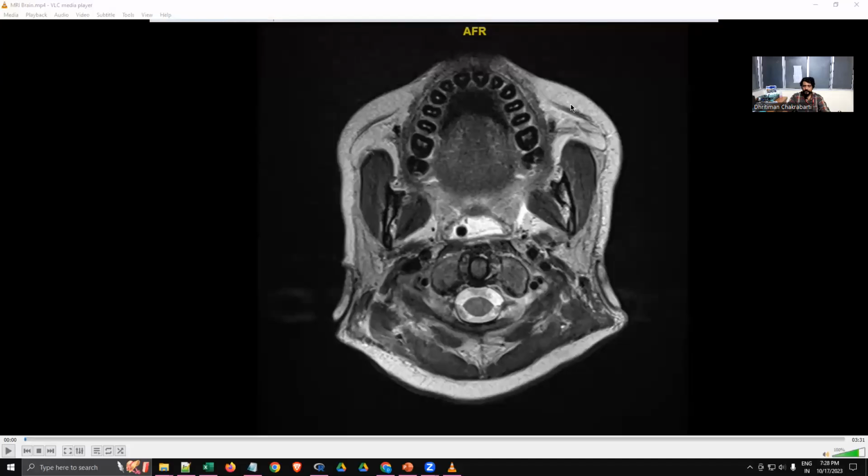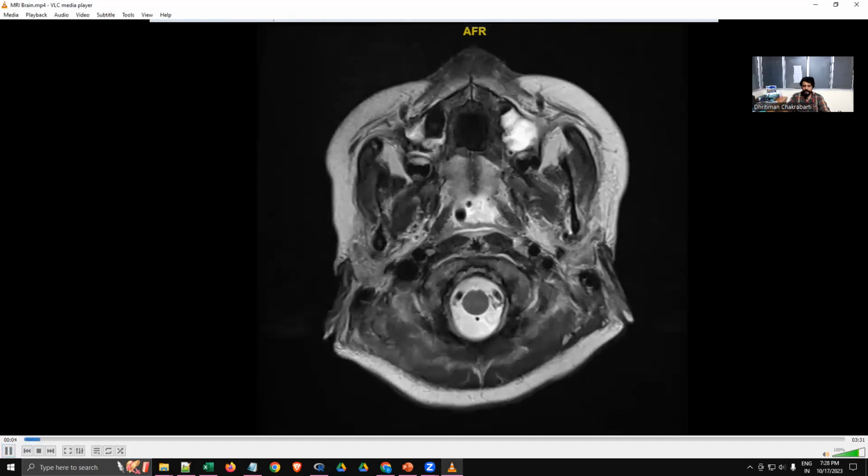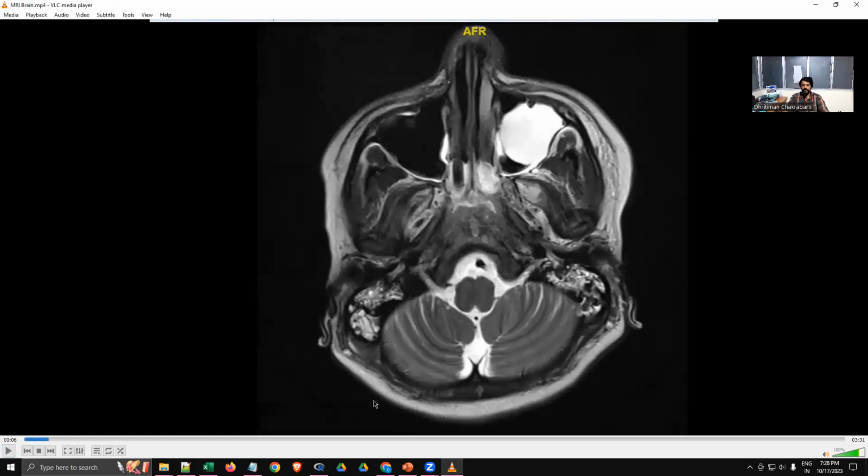So this is a video that I took of a patient who is suffering from status epilepticus. Overall, the brain anatomy appears to be normal. This is just for showing you the way the images look. It's not about the pathology. First we are starting with your T2 images. Let's scroll through it. You'll be able to notice that the arteries appear nicely black, and you can see the cisternal spaces with CSF inside them. They are all appearing bright white. Okay, let's go.